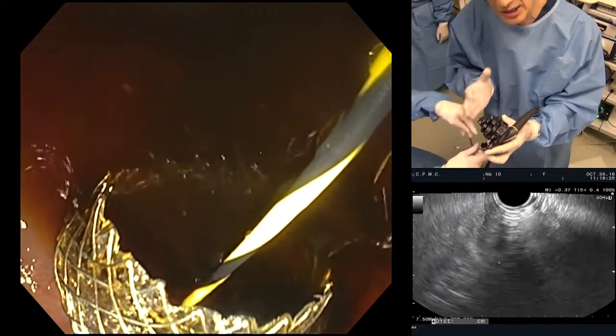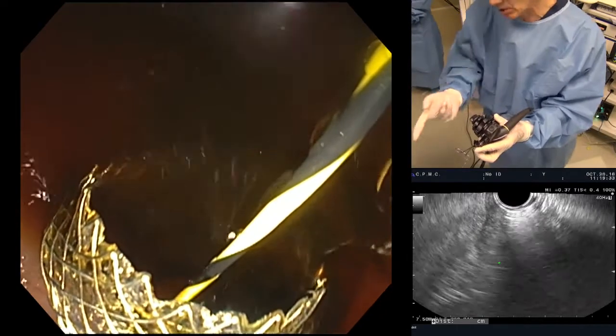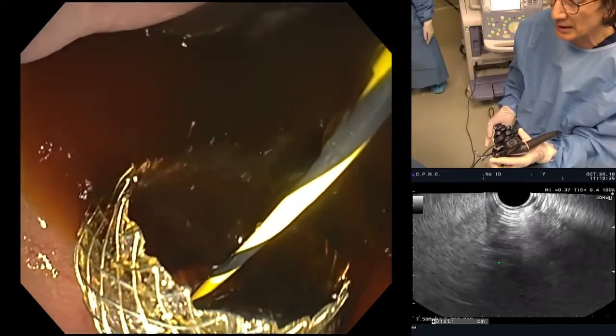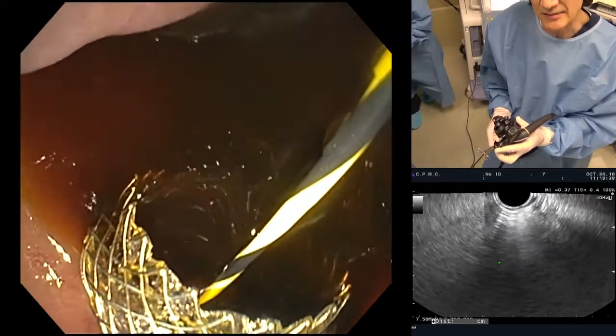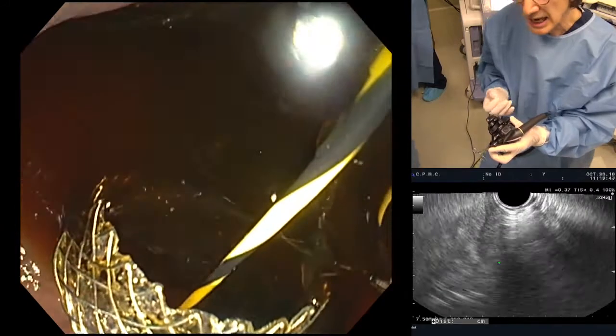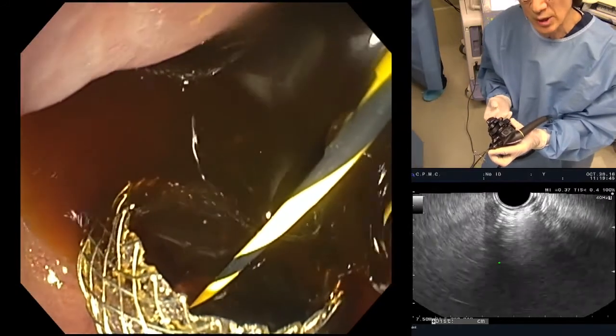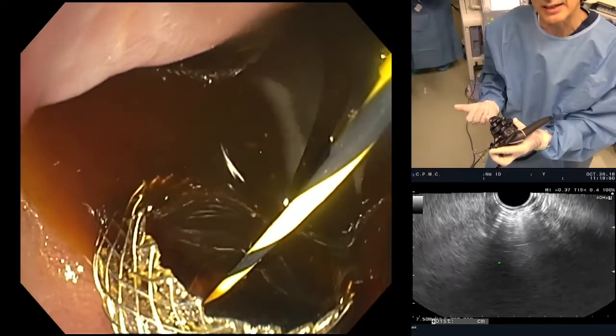I just want you to understand when we're doing these procedures, what goes into developing a device. We're going to dilate this up to a 12 millimeter. So we'll use a 12 to 15 balloon. What goes into developing a device? And that's where I've spent the last decade of my life really understanding how, because I've only been at the opposite end, right? The receiving end. I'm the doctor.